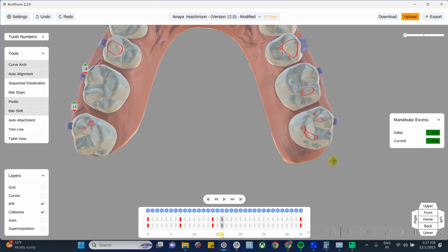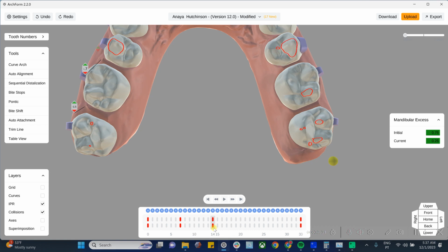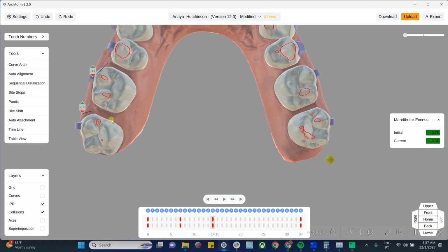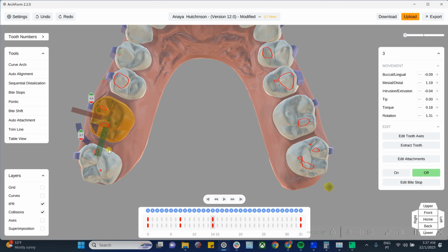So just getting those first two teeth. So the movement now on the molars is complete on the second molar. You see there's no more movement on them for the rest of the treatment. Now we can skip to the first molars. So let's take a look real quick.